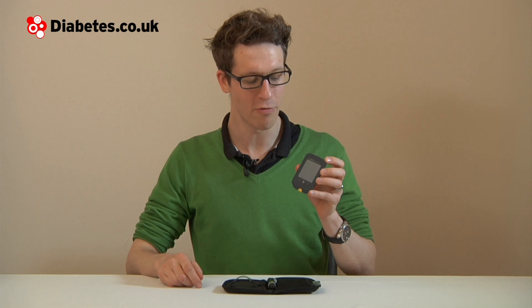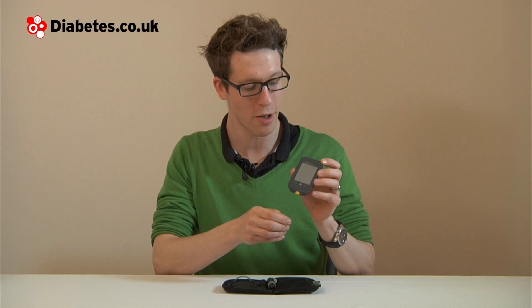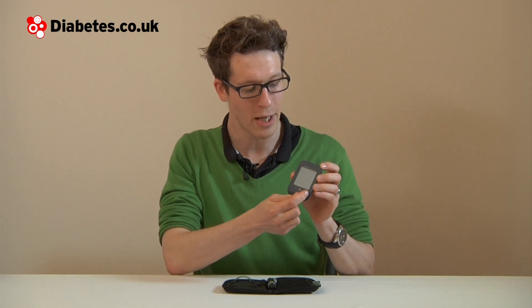The meter alerts you to any high or low sugar level trends. If you get a reading of 3.9 or below, you will see an arrow pointing downwards displayed here. If you get three different low readings within a period of five days, you will notice you get a flashing down arrow here.